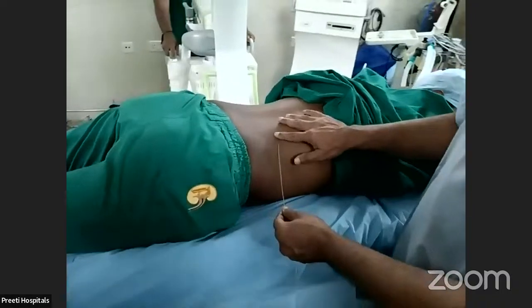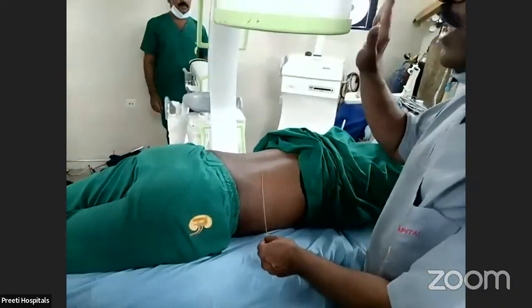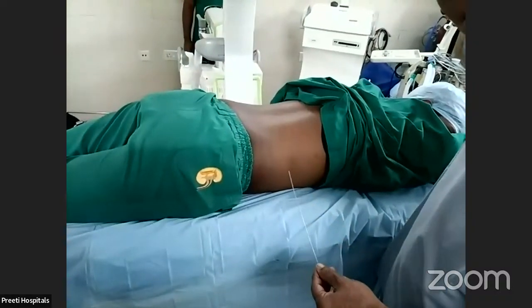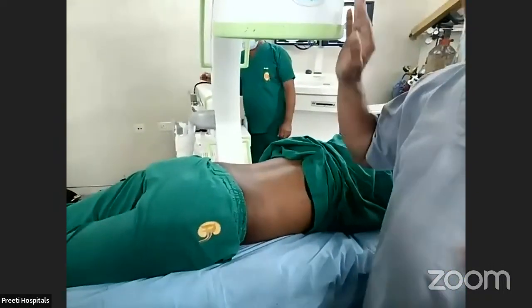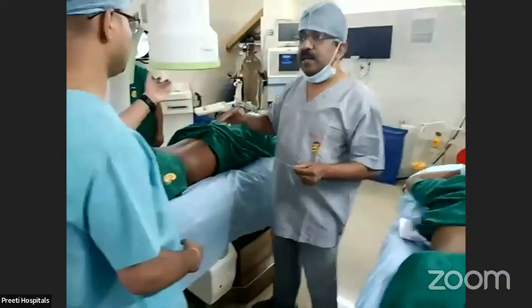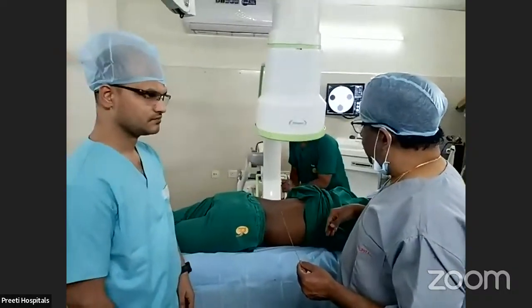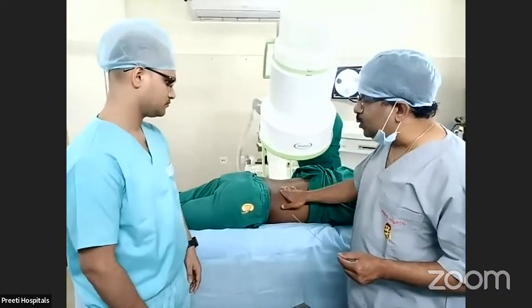So, if you keep the needle, normally in prone PCNL, how is this C-arm tilted? 30 degrees towards the receiver. Where is the producer? Here. The rays will be produced here and received here. So normally in prone PCNL, surgeons tilt it 30 degrees towards me. What will happen if the needle is more posterior?